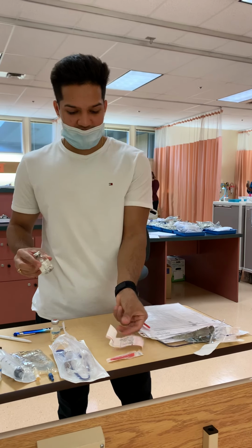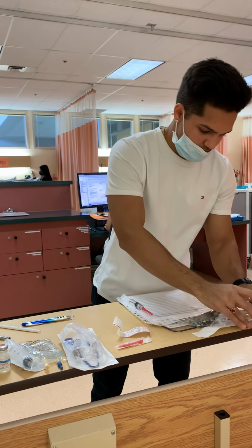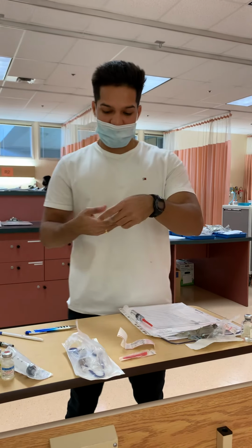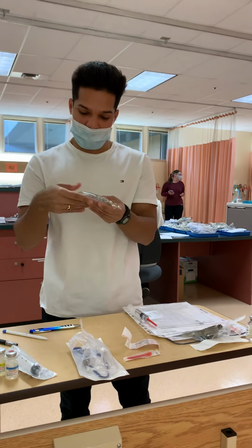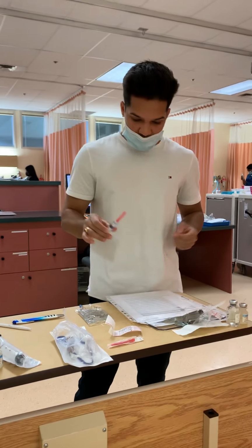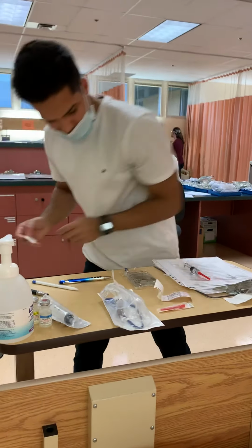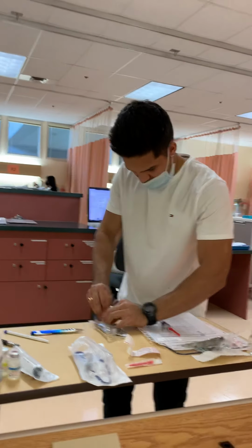Okay, so now once I've done my second check, I can put these in my MedWaste containers. Okay, and now I can pull out my mini bag that I'll be diluting it in. This is a 100 mL bag of normal saline, and I'm just making sure it's not damaged or expired and it's good to use. Okay, and once I've done that, I'm just going to be taking an alcohol swab, wiping my port for 30 seconds. Wiping my medication port for 30 seconds.